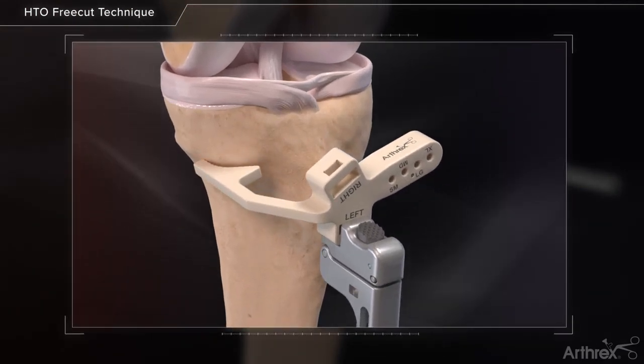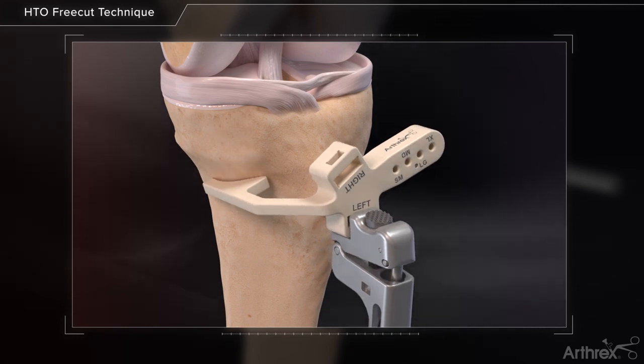Optionally, if preferred, the location of the hinge pin can be determined first. The i-Balance extramedullary alignment guide, in conjunction with the radiolucent hinge pin guide, can be used to estimate approximate implant position medially. Appropriate slope, varus valgus, and internal-external rotation can be adjusted with the EM guide.